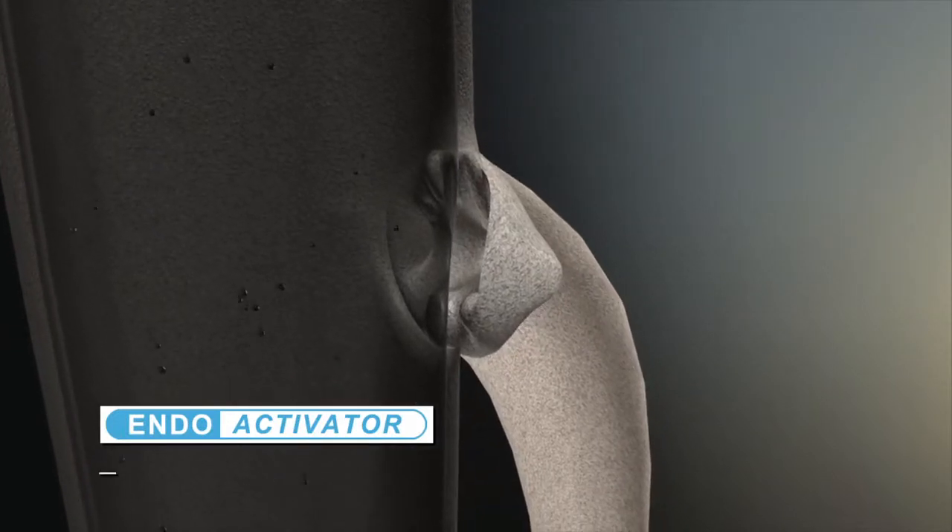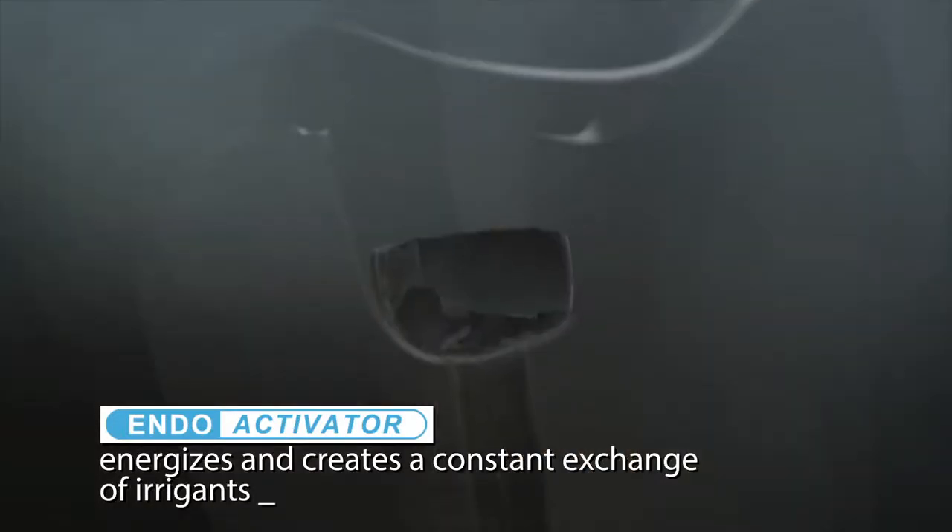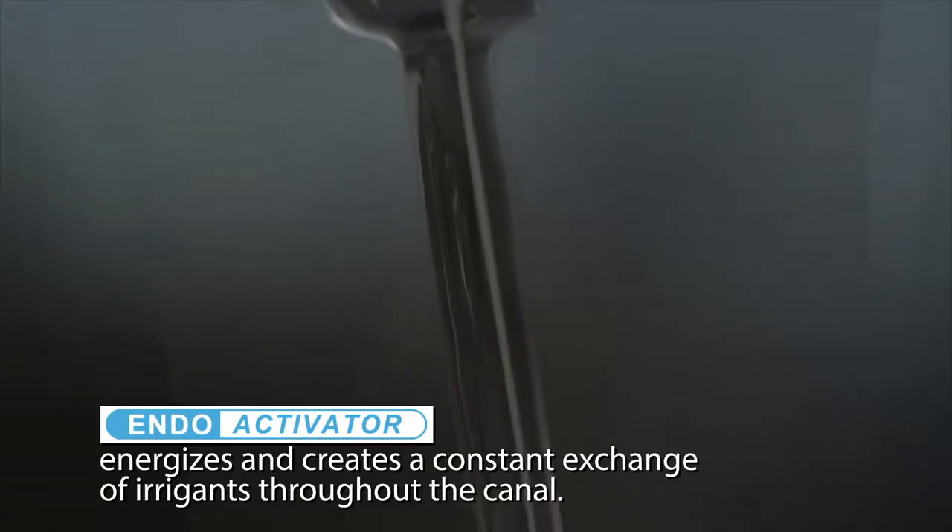Use of the EndoActivator vigorously energizes and creates a constant exchange of irrigants throughout the canal. This hydrodynamic phenomenon of activated fluids promotes deep cleaning and disinfection into lateral canals, fins, webs, and anastomosis.